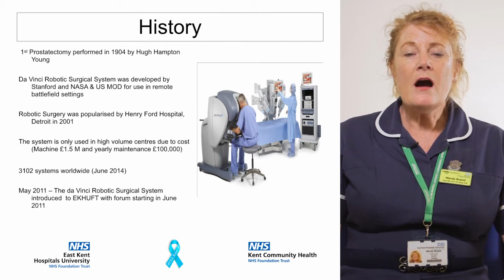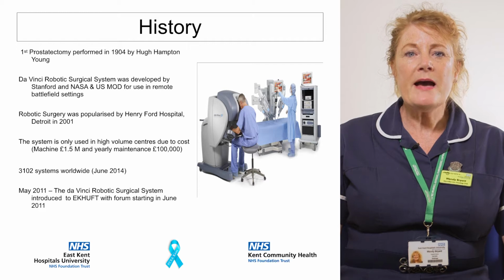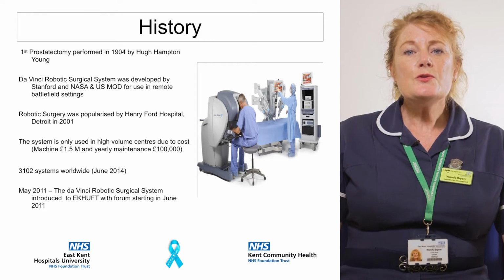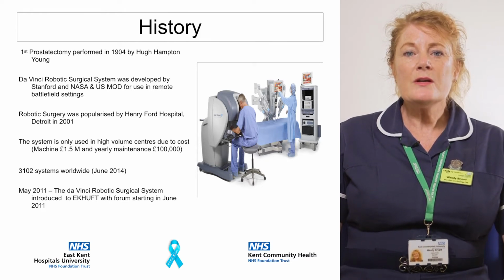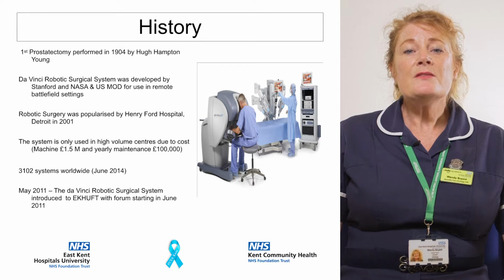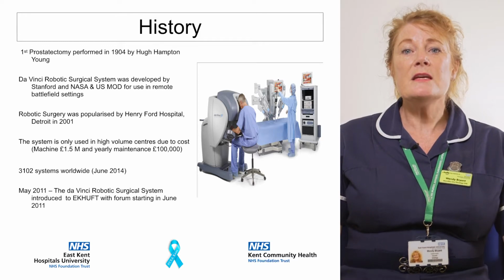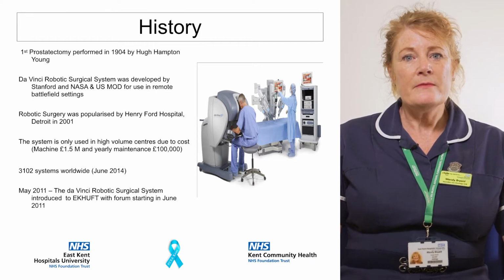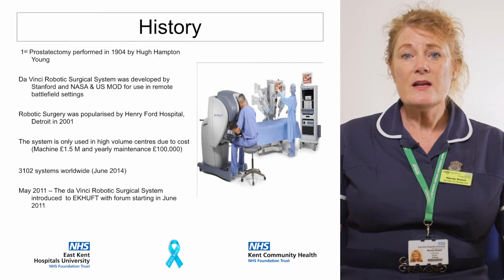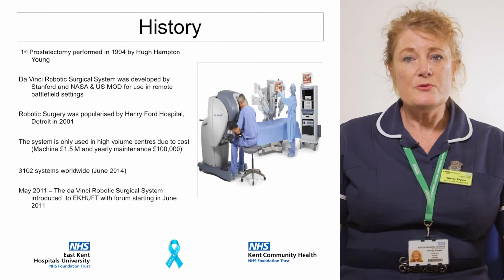Systems are only used in high-volume centres due to the expense of each machine costing £1.5 million and yearly maintenance of £100,000. In June 2014, there were 3,102 systems worldwide. In May 2011, the Da Vinci robotic system was introduced at East Kent Hospital University Foundation Trust, and the Prostate Forum commenced in June 2011. Kent and Canterbury was the first hospital in the south east of England, outside of London, to offer this advanced treatment option.